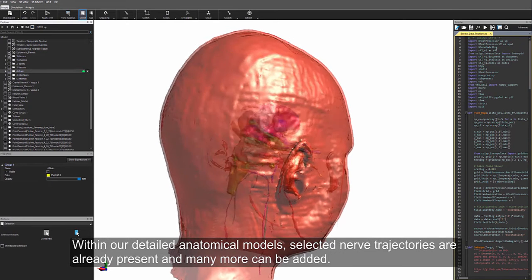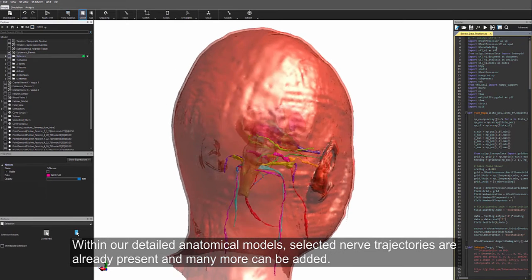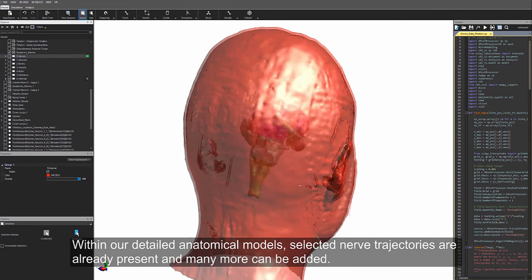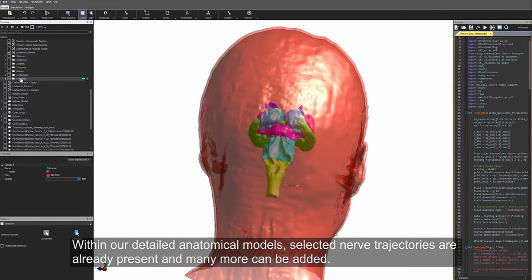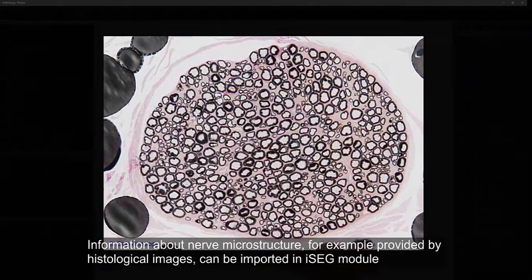Within our detailed anatomical models, selected nerve trajectories are already present and many more can be added.